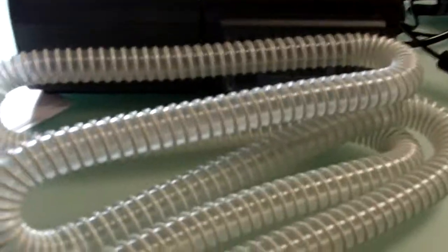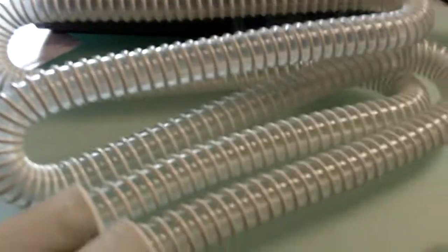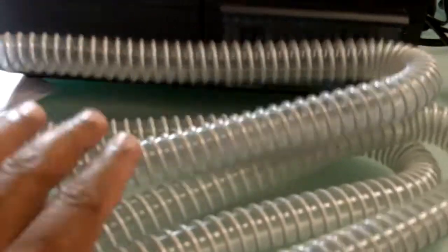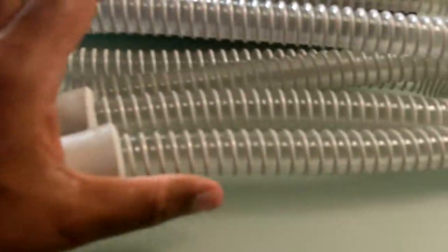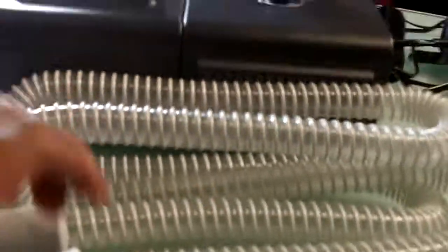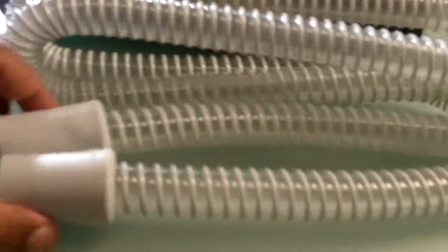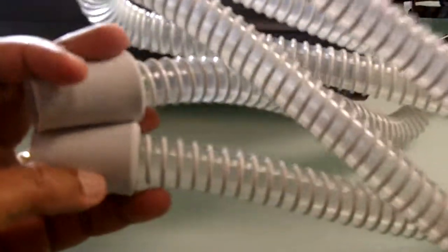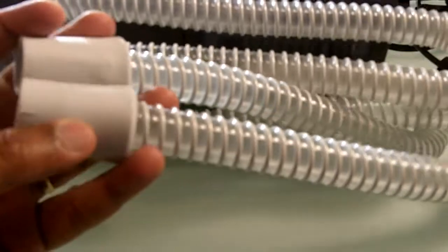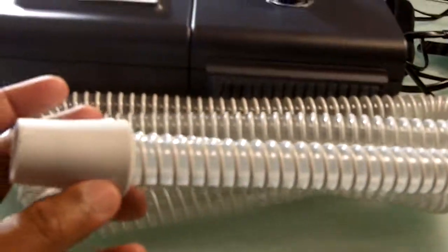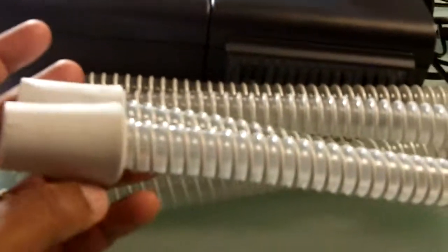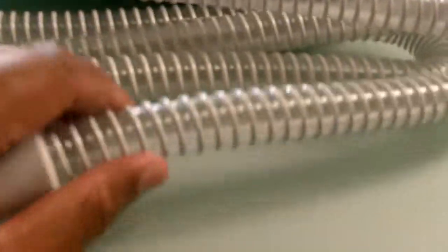In this short video, I'm going to be talking about the tubing. The tubing that comes with this is the performance tubing, made by ResPronix.